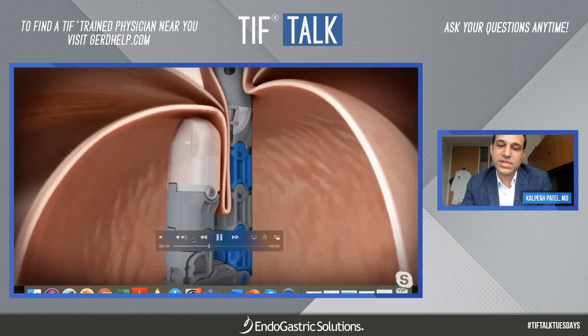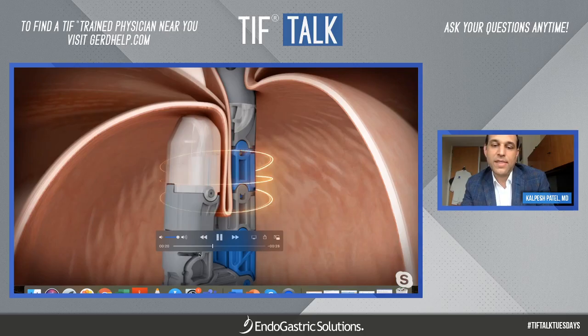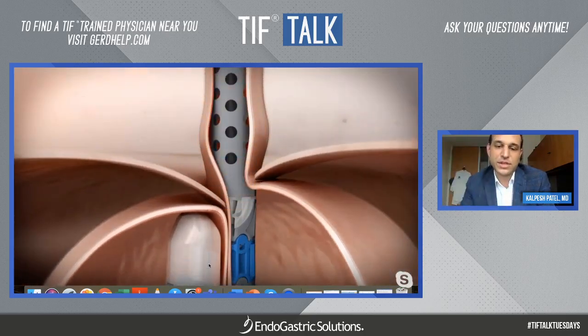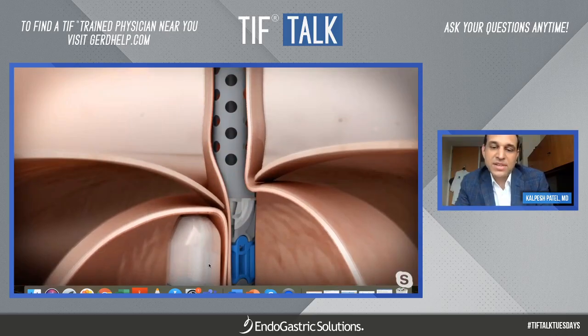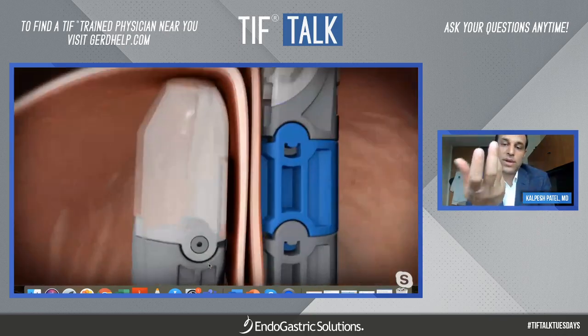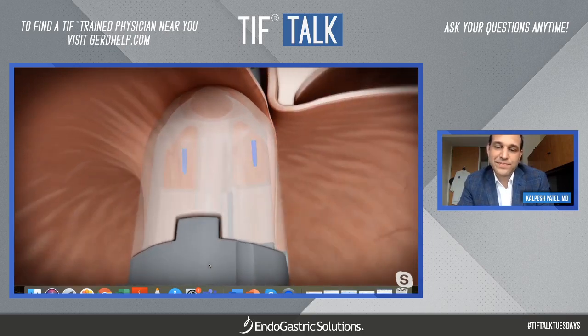You can see the critical step there. Up here, we're narrowing the junction between the two. We're allowing this, which is your diaphragm, to actually do its job by pinching this junction as well. In order to keep this in place, you're going to see a couple of fasteners get fired, and those are going to encourage the body to heal in this position. This is done in a 270-degree fashion around the junction. There go the fasteners there. They look like little price tags, actually.